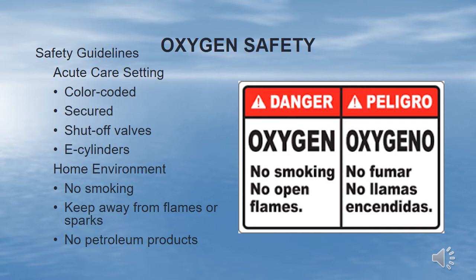Though respiratory therapy routinely changes cylinders in hospitals, nurses may be required to do so. The nurse should be properly trained before attempting to perform this task. Nurses preparing patients on oxygen therapy for transport should ensure the portable cylinder has enough oxygen supply for the trip. If the patient is in a long-term healthcare facility, the patient may be making a round trip, like to an appointment and back. The tank should have enough supply to accommodate both trips.